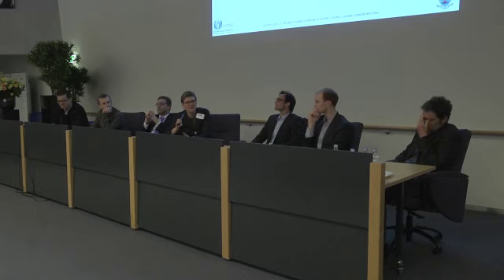We have ended up in our unit with a very simple practice. We have found out that 1.0 is a good guess to start from. We did it more complicated initially, but now we set the Nava level at the beginning to 1.0 and adjust according to Edimax, which we keep between 5 and 10 mostly, or up to 15.